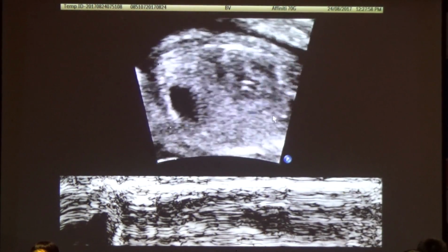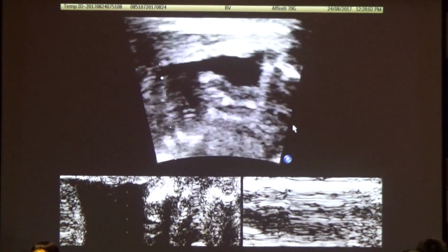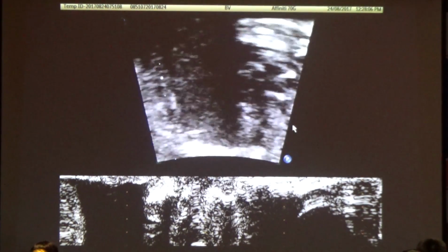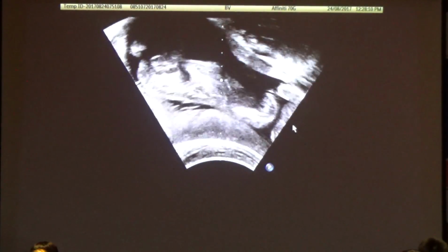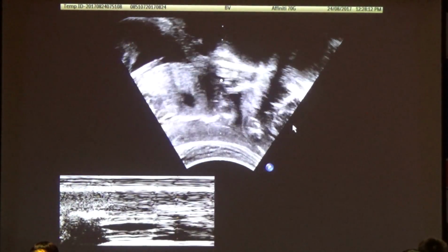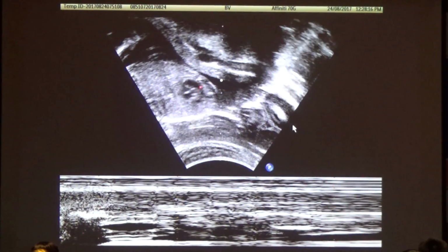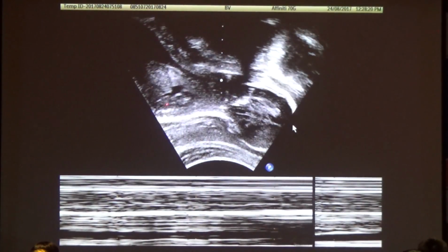Now, what I haven't really had much luck seeing, and I need to go closer to the head. So we're going to come out of zoom again, because you can't really look and zoom, you have to unzoom it there. Okay. There's the arch. Ah, okay.